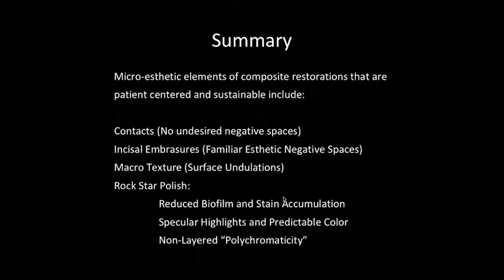This is kind of what I'm calling the familiar aesthetic negative space zone. And then the macro texture, focusing on just achieving the subtle surface undulations that are polishable, so that we don't have issues with staining and biofilm accumulation.